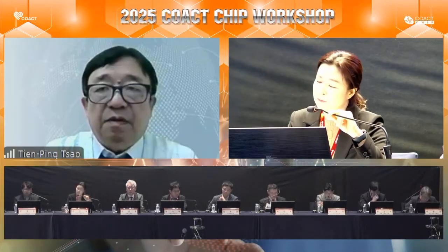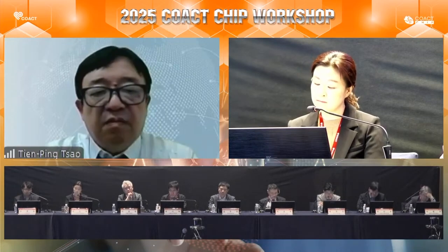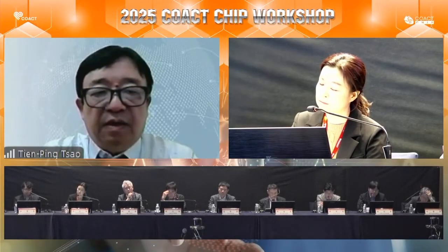Yes, if the dissection is less than type C, we can use the IVL balloon safely. But if the dissection severity is more than type D, I think there is a real concern about vessel injury. So in most cases we can use IVL even after balloon predilatation, or even with some dissections.